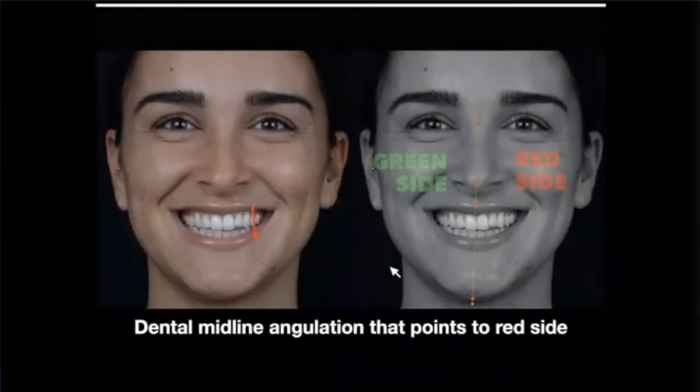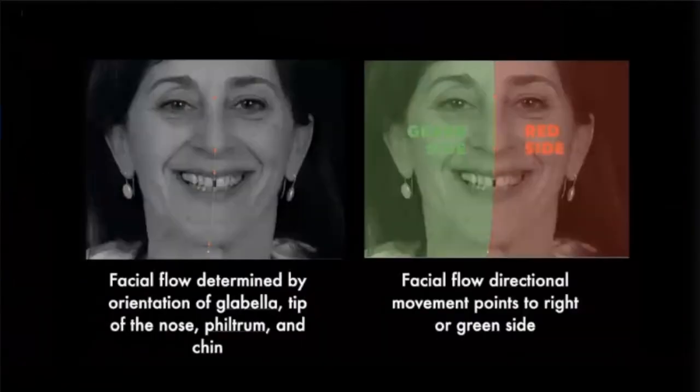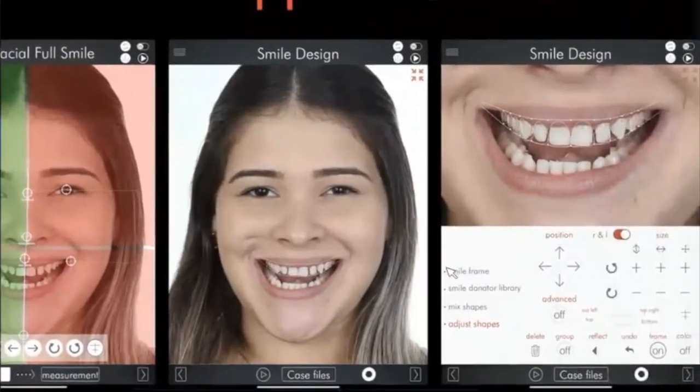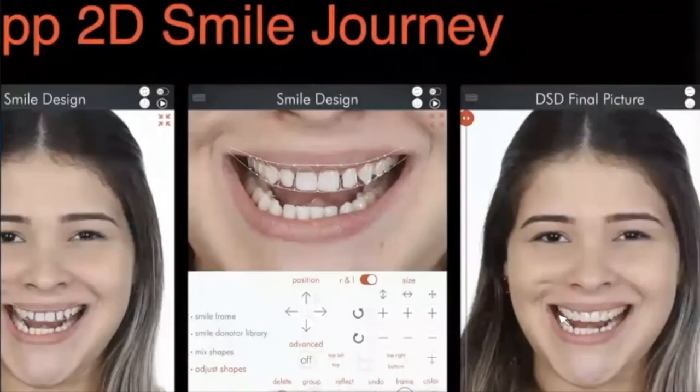Here is a very good example of what happens when the angulation of the smile is just 1-2 degrees in the wrong direction, right? So by creating crossing lines in the face, we create tension. To make it easy in the app, we integrated the facial flow. So we can analyze the face based on the facial proportions and analysis. We set the smile frame. We adjust the smile frame and create outlines for the correction.